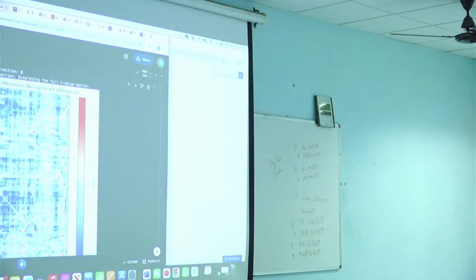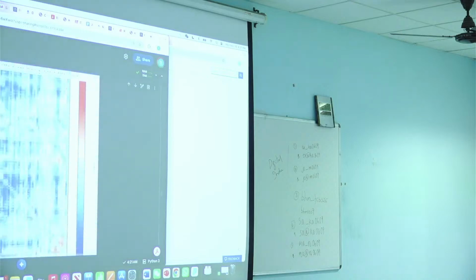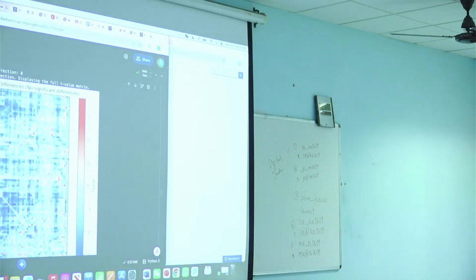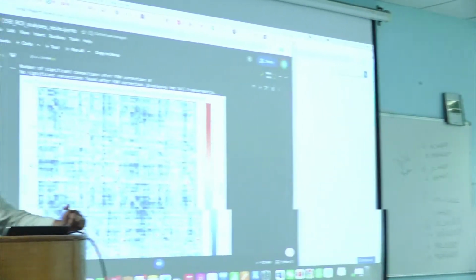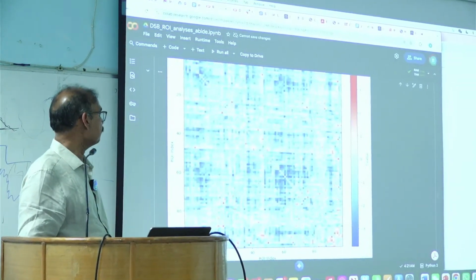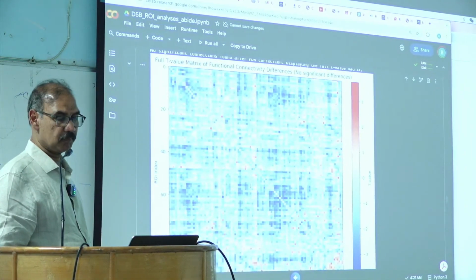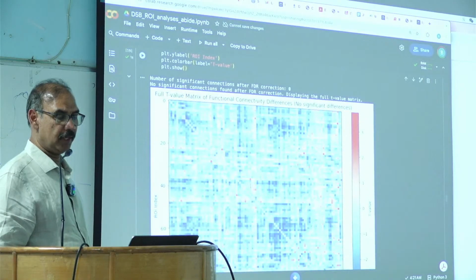So this one is using the analysis after FDR correction with 100 ROI between healthy and autism.